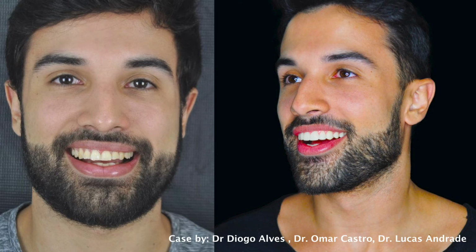And DSDapp really allows you to not only create smile simulations, but also 3D motivational mock-ups and treatment guides to give you a satisfying end result. And one of the greatest things is that you are now in control of the entire process, so you don't have to send it all to the lab if you don't want to. You can do everything in-house.